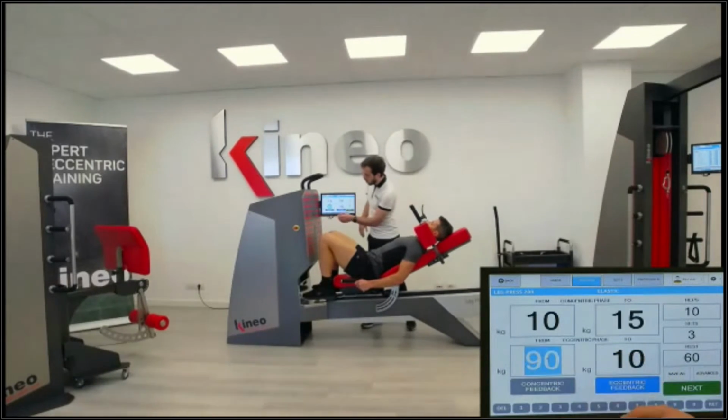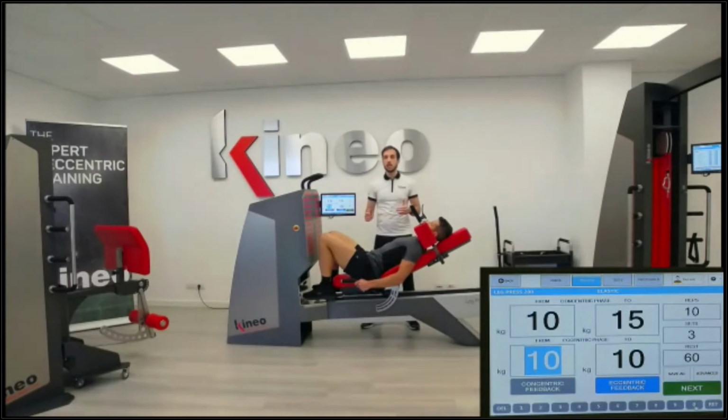And of course, here, one thing that we can do is to avoid having an elastic. So in this case, we are programming an elastic just in concentric and then going back with the same load. So let's imagine that Damiano is a patient, has a surgery, and he needs to start working early. So we must be in control of these tissues, in control of his pain, and with elastic, we can help him try to rebuild his capacity of work.